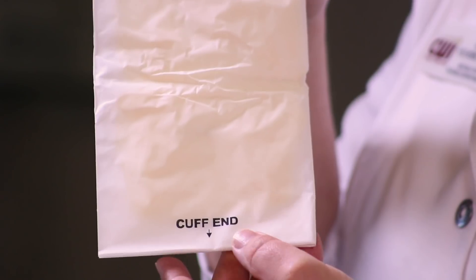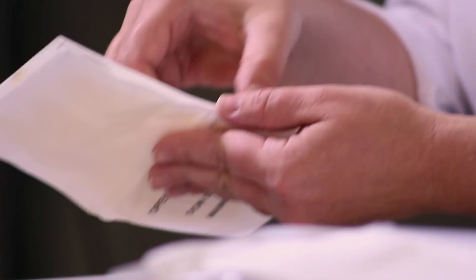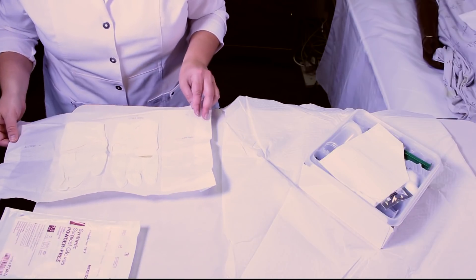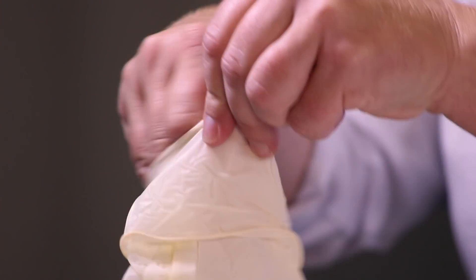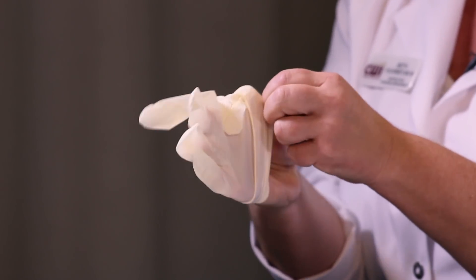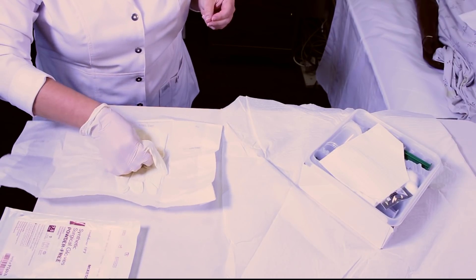On the kit, the outside of the gloves say 'cuff end,' so that's the side that will open towards you. Place them on the table, then take the edges and open it up so that you have a flat surface to work from, being careful not to contaminate your other sterile field. Take the inside cuff with your non-dominant hand. Don't worry when you're sterile gloving if you get two fingers in one of the glove holes — that can be fixed after you're completely sterile.